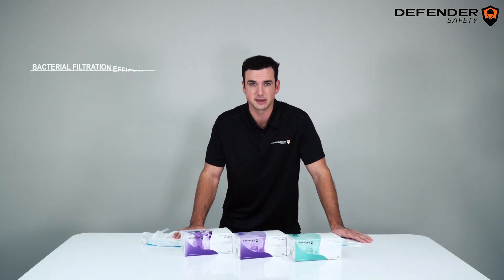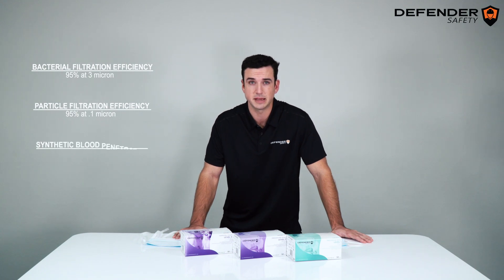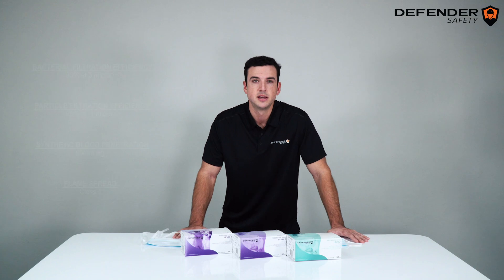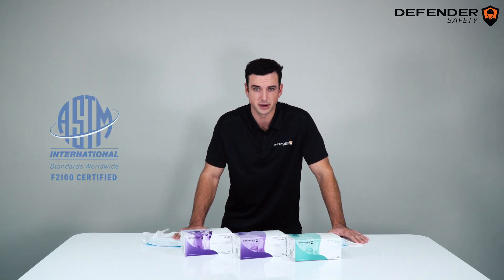95% bacteria filtration efficiency at 3 microns, 95% particle filtration efficiency at 0.1 microns, an 80 mmHg blood splatter rating, and a Class 1 flame spread rating.